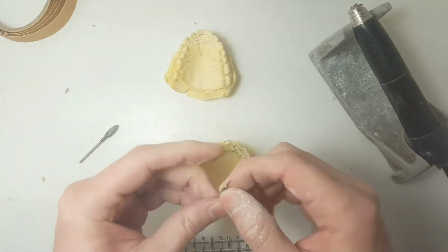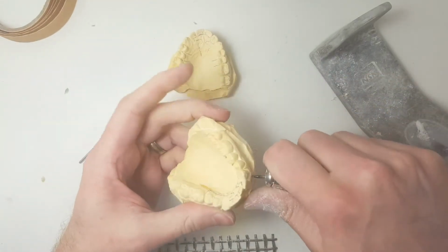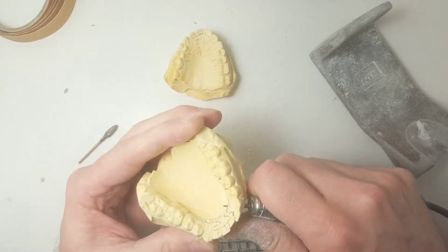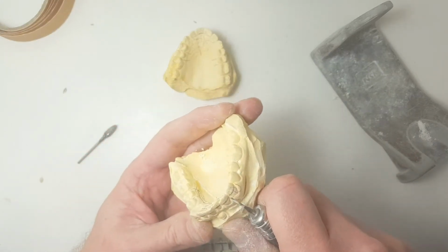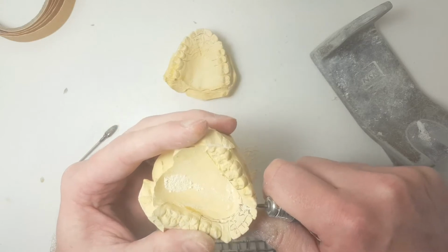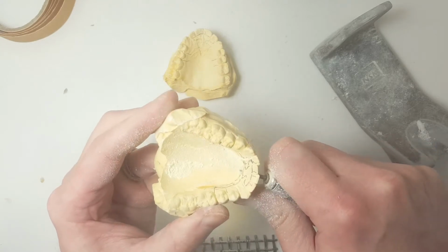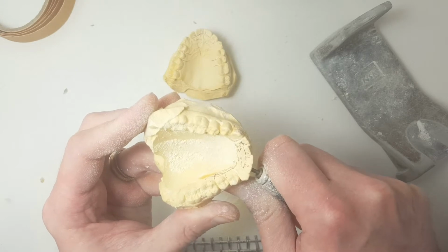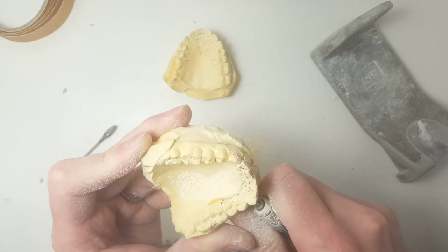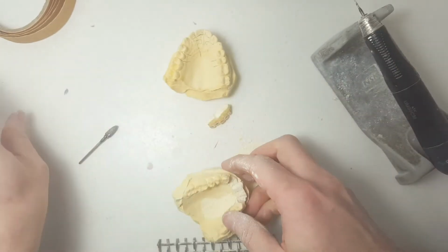So now I'm going to get my cutting burr here. I don't use this one to poke a hole. It doesn't drill very well that way, but it does do a good job of cutting sideways. So I just go in between the teeth, only cutting out the gums, and I'm going to fill in the gums part, the tissue part, with pink wax. I usually like to try to score it a little bit just for wax retention.